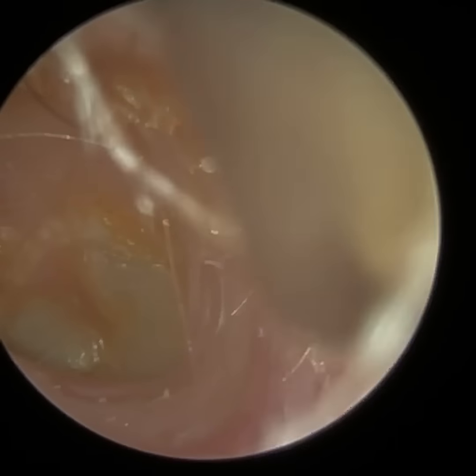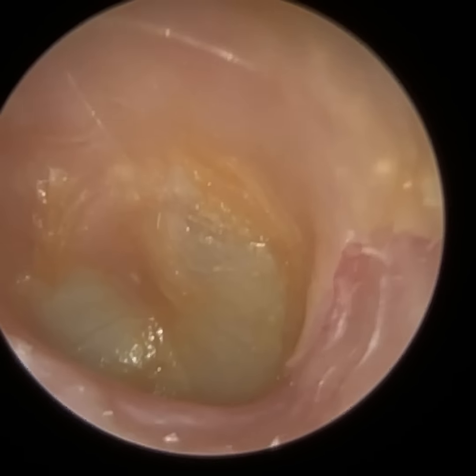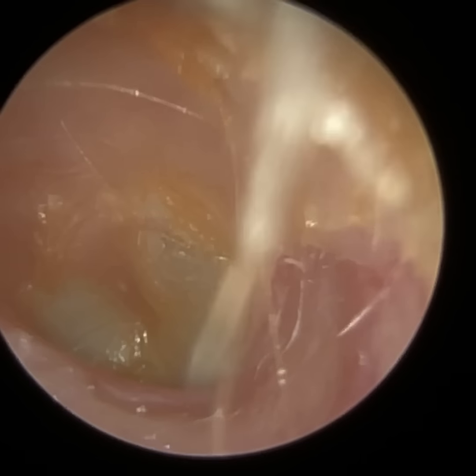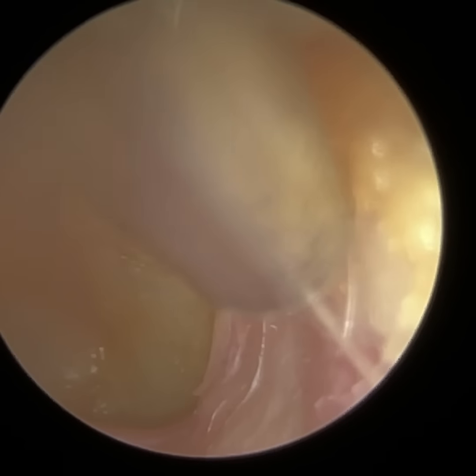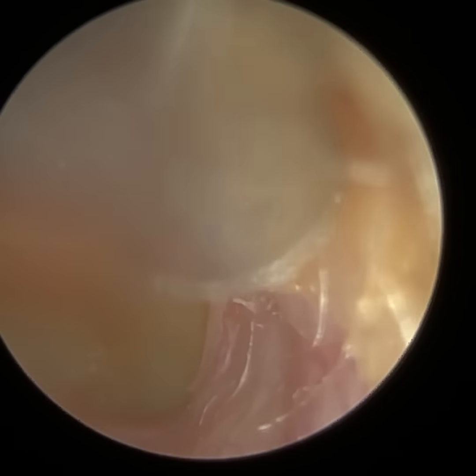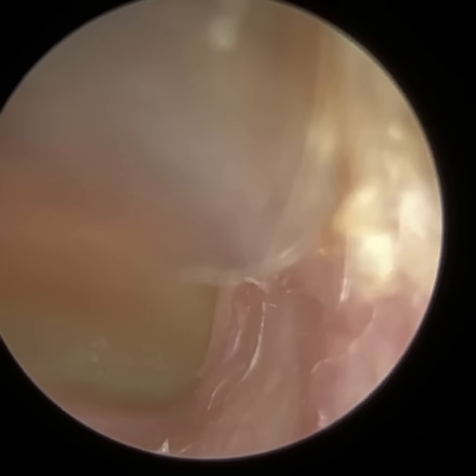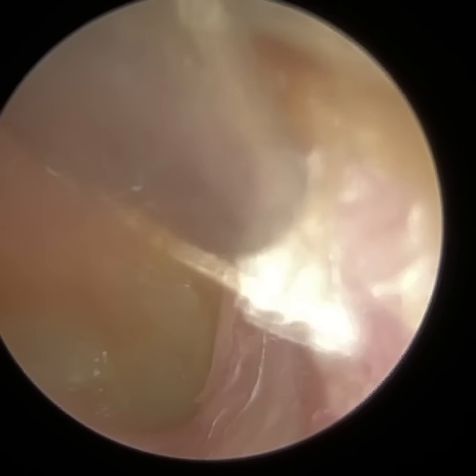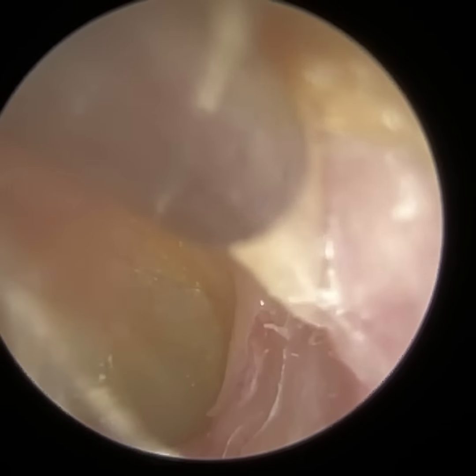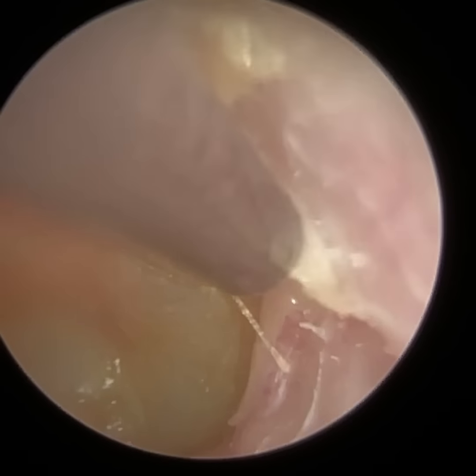And the organ of balance is affected by pressure and temperature. So when you perform microsuction, it reduces the temperature, and by reducing the temperature of the ear, you inhibit the function of the organ of balance. So when you're sat still, your brain should receive equal messages from the organ of balance in your right ear and your left ear. But when you perform microsuction in this patient's left ear, as we are here, this inhibits the function of this organ of balance. So the brain is receiving less signals and messages from this ear in comparison to the right ear. So your brain is tricked and fooled into believing you're moving.